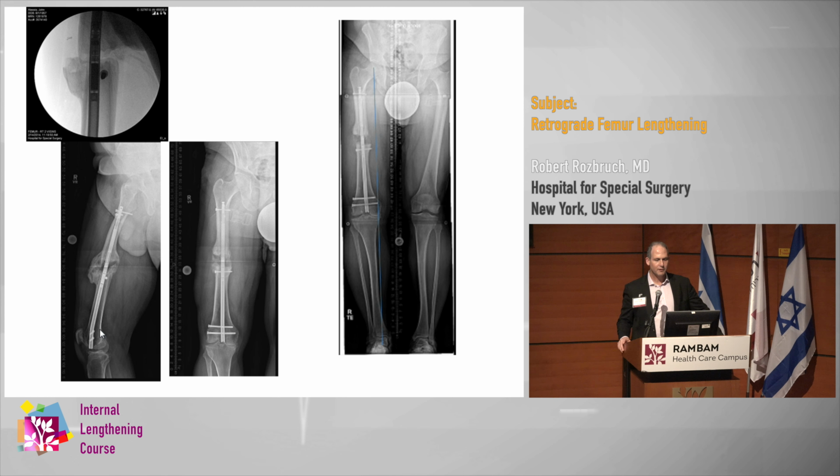The interesting thing is that when you correct some of these deformities, you'll find that the patients feel a lot better, and they may not be necessarily interested in the total knee replacement so quickly anymore. And so, in many cases, you will delay that more so. But here, the blocking screw was helpful to correct the procurvatum deformity that you saw.